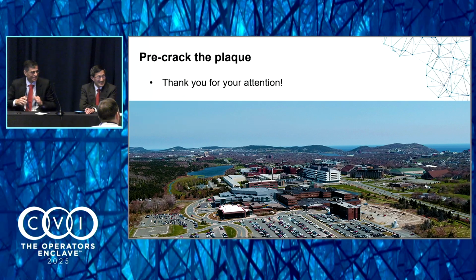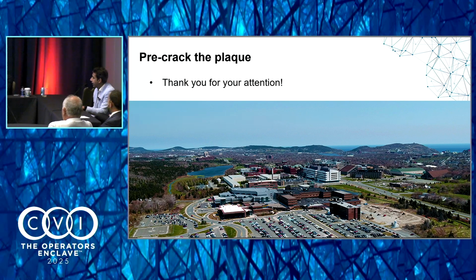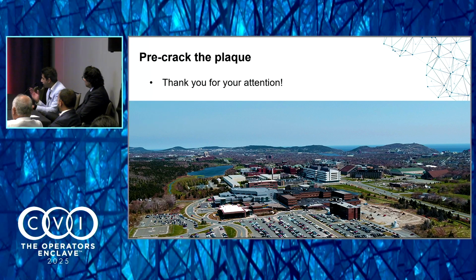I have not used this technique, but I'm really intrigued. The smallest OPN we have on our shelf is 2.5. And so for a number of these lesions, if they don't dilate with an NC, we either use an OPN or Shockwave in that case. But I'm intrigued by this technique, and maybe it'll spur some ideas.